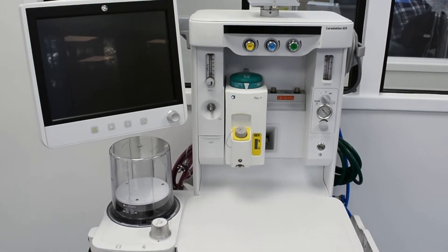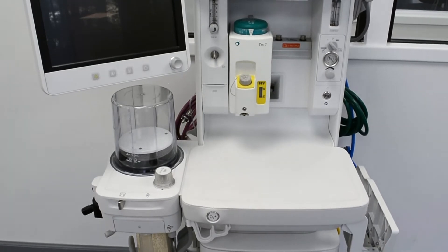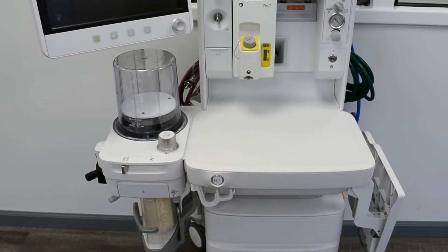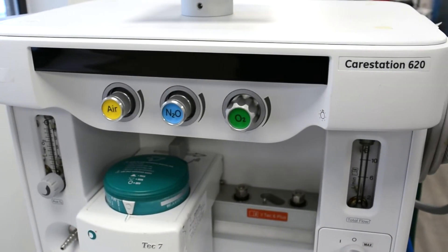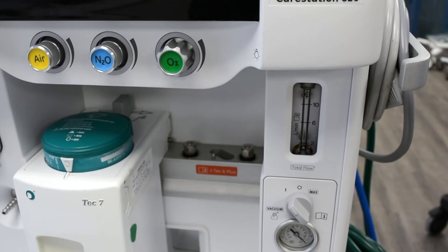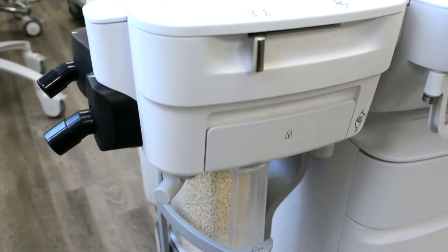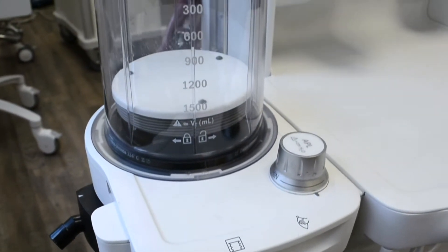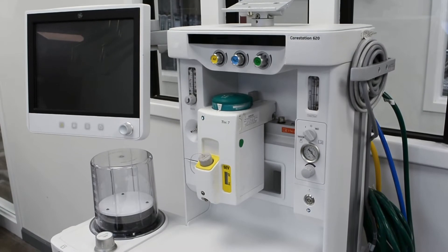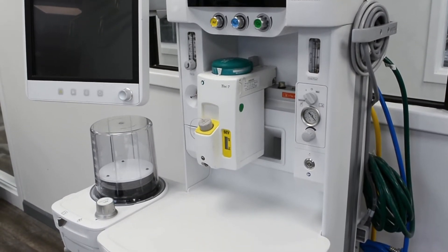The GE CareStation 620 is a versatile anesthesia machine with a compact breathing system that supports all patient types, from neonates to adults. The compact breathing system allows fast gas kinetics, rapid wash-in and wash-out, and offers continual fresh gas flow with fresh gas compensation during mechanical ventilation.